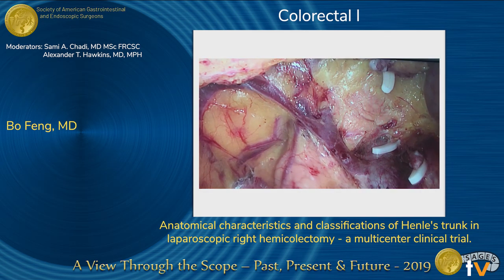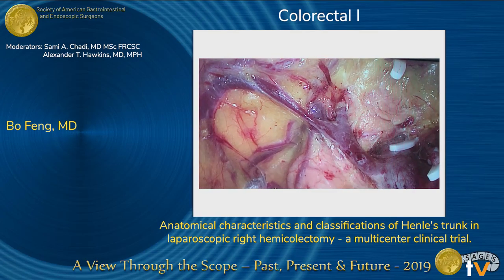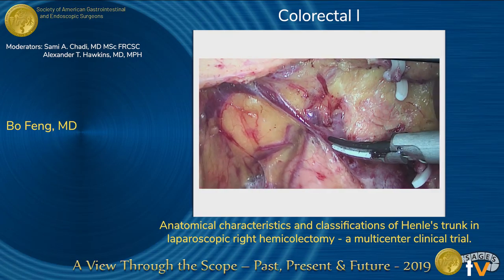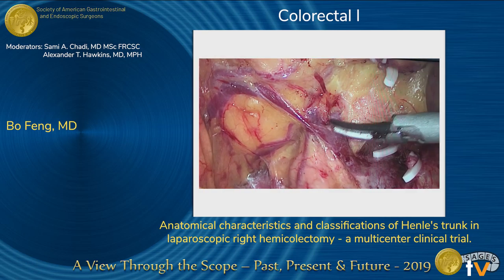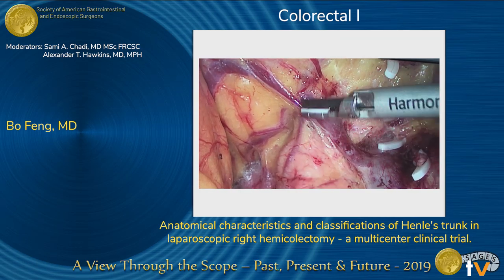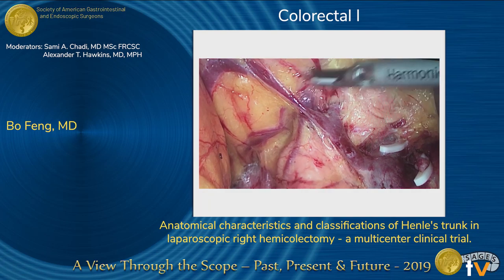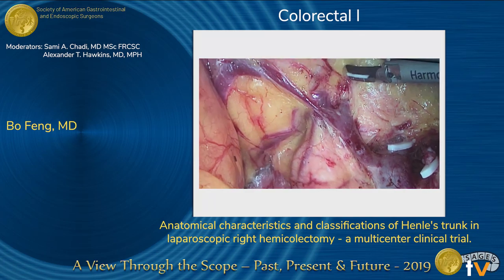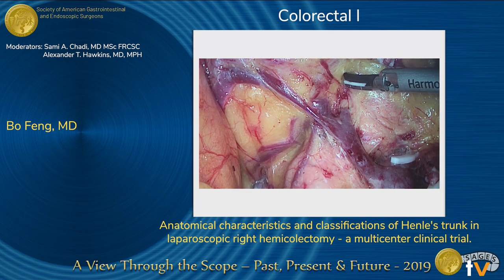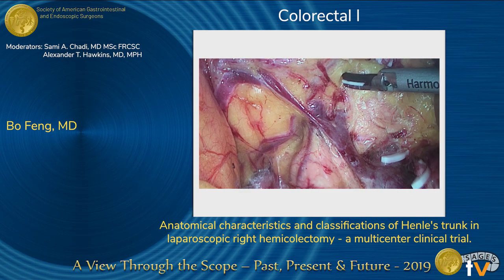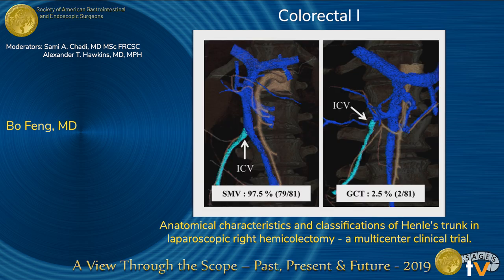In this case, the anatomy is really complicated and we initially cannot identify which type it is. We need to perform a hybrid procedure — approaching from middle to lateral and from upside down. We ultimately identified this as a type 2 case.